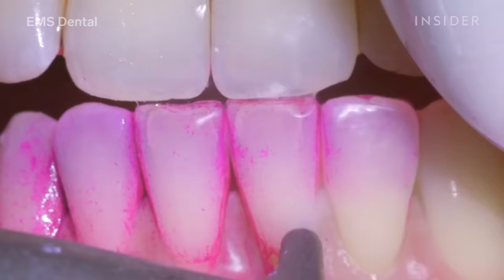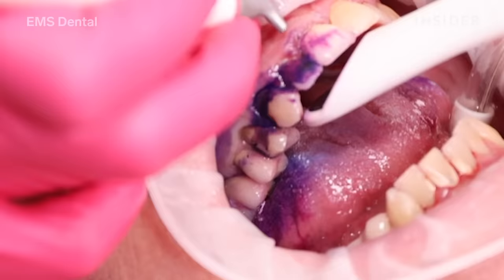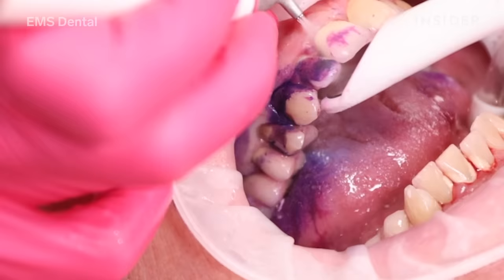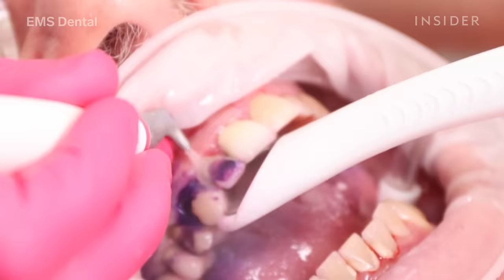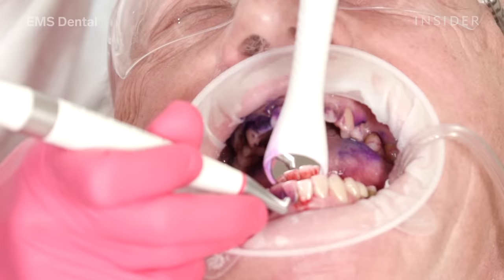Airflow Max will remove 100% of the biofilm from the teeth and all of the surrounding tissues, including underneath the gums where it's dark and warm and the biofilm really likes to hide. I'm also using it not just to take the biofilm away, but it takes the stains away as well, so the mouth looks and feels super clean afterwards.